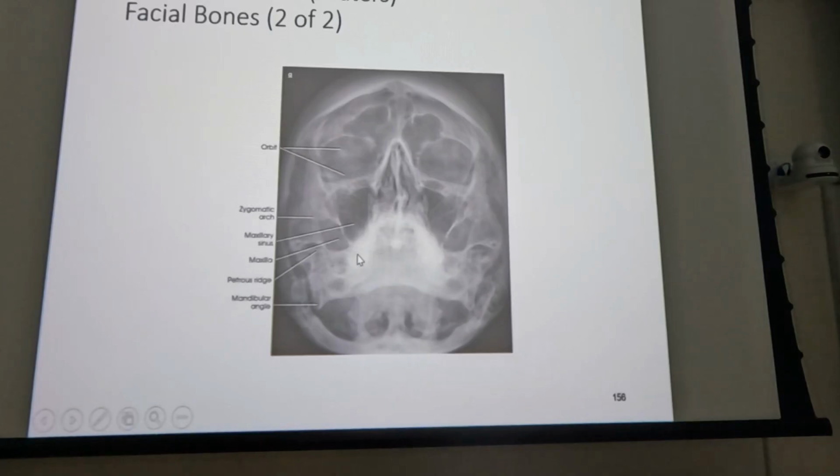Okay, so this kind of continuous big light blob of goo, that's your mandible, that's your petrous ridges, everything's stacked on top of each other way down there. Okay, so just looking at that, what do you see?